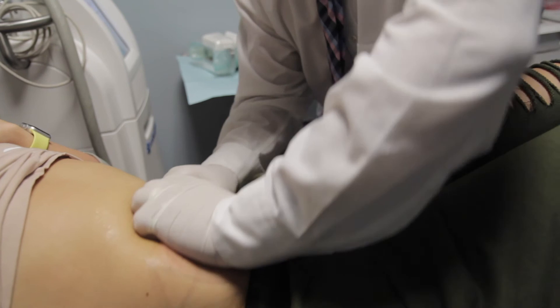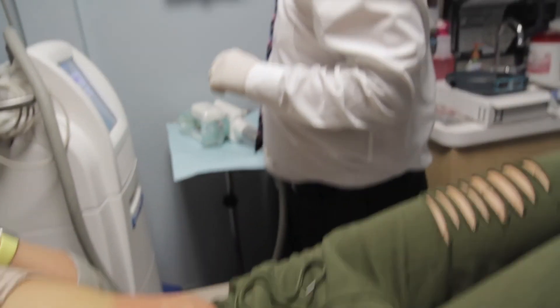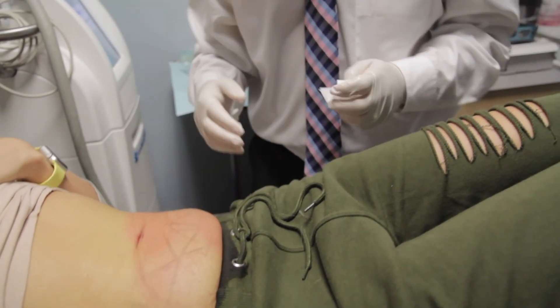We're almost done giving this a really good massage. We massage the area and then we wipe it down. These are my markings and those will be wiped down as well. The patient is going to go home, chill and relax, and resume normal activities tomorrow. We'll see her back in two to three months, re-evaluate the area, and if needed, do another session. I always say continue doing whatever you've been doing — if you're still exercising, continue to exercise and just get back to normal life. Thank you so much, have a nice day.